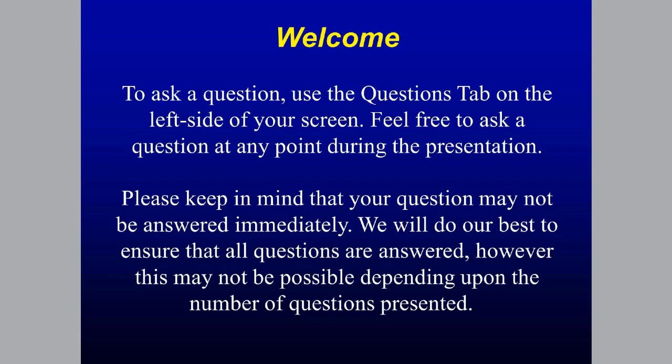Yeah, the answer to that is no. There's no concern whatsoever. If you have a patient who, for example, is in the ED or presenting with MI and you need to use contrast to see what's going on, you use it. There's no special safety considerations for patients in the midst of having an MI. As a matter of fact, we did a single center study of over 2,000 patients with suspected MI. And I did a study myself where I did contrast perfusion imaging of patients on the cath lab table, looking at myocardial perfusion before and after primary PCI for MI. And there's just no safety signal to say that it should be withheld for patients with acute MI. So it can be done and it should be done.